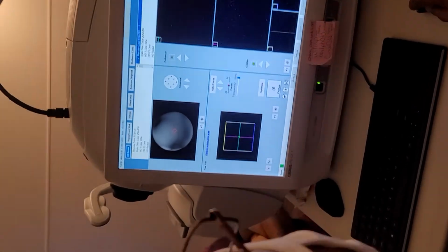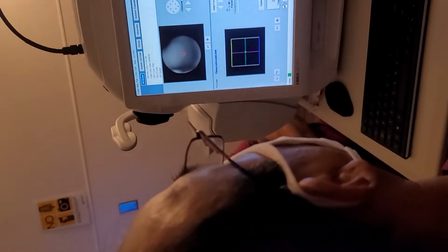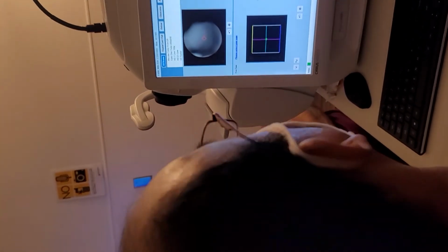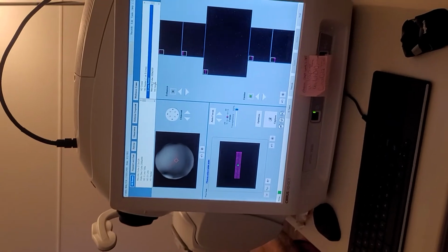You've only taken one image of the macula. The other one is important. You need to take it. What is the one that you need? Don't tell him. Nobody tell him. 5 lines is good. Yes, because if everybody keeps telling you, then you're not going to know, right? This whole crew isn't going to be with you.